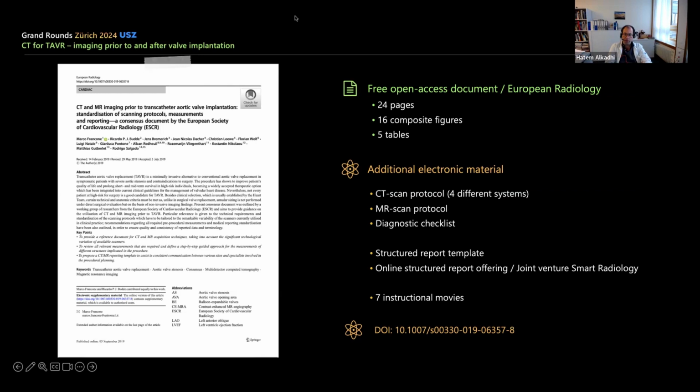One additional question, perhaps a more technical one. When it's about imaging patients with suspicion of a restenosis after TAVR, what protocol do you apply? Well, we use the same cardiac CT protocol as always, with the modification that we scan for the full heart range, so for complete systolic and diastolic phase, and that we don't use any dose modulation because we want to have the same image quality across the complete heart cycle.